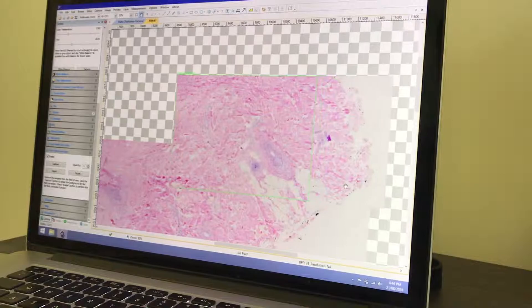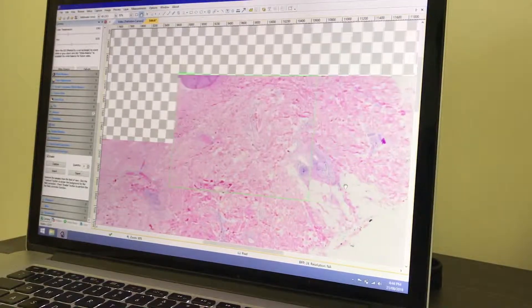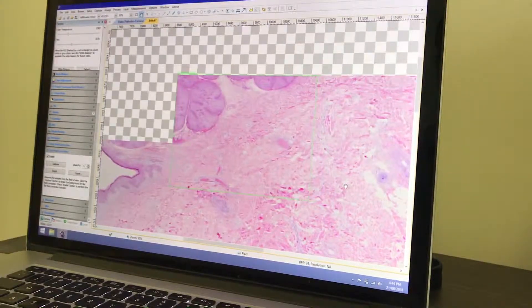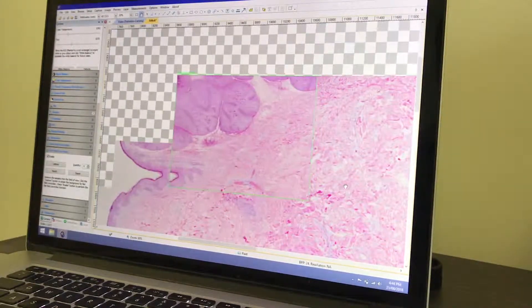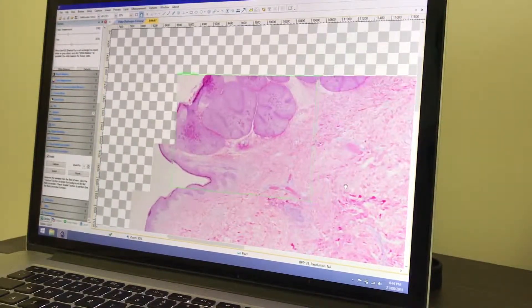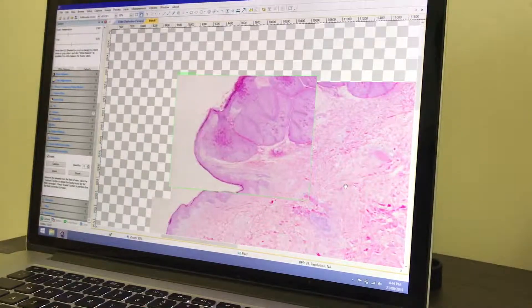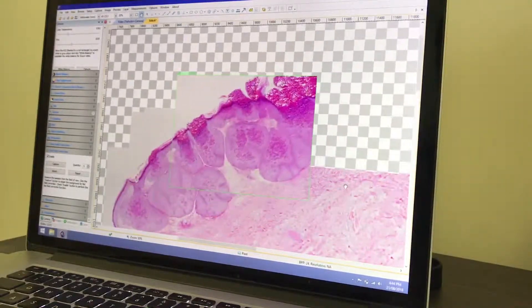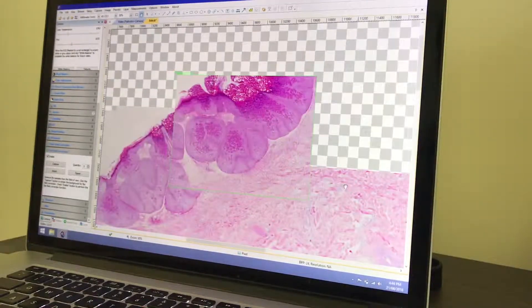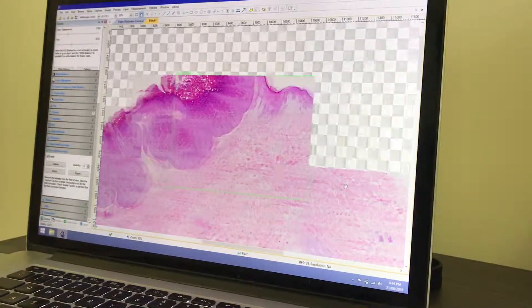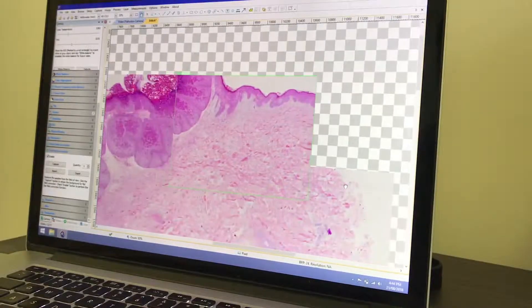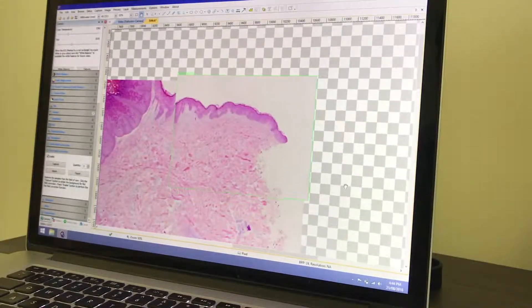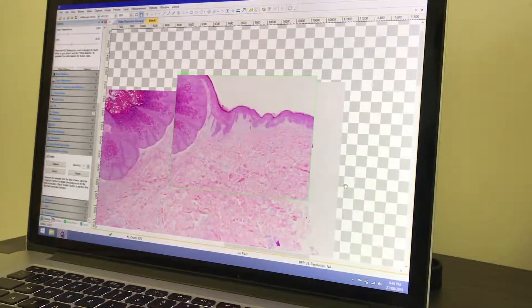If I were to move too fast, the frame outline will become orange, warning me my stitching is struggling to find matching points between frames. And if it were to become red, then gaps will appear in the output. The key is to move at a pace that your computer can keep up with.